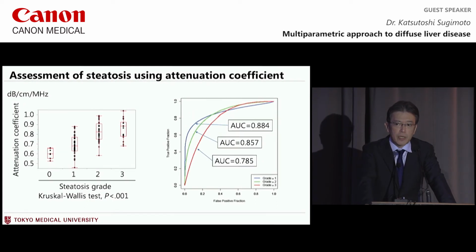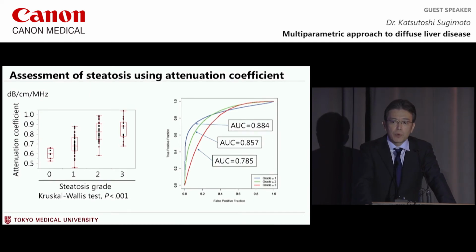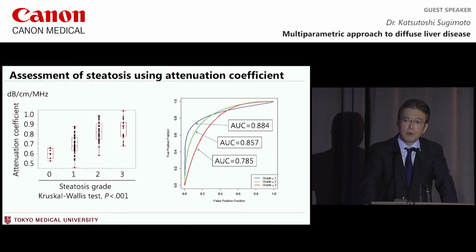This shows the assessment of steatosis using attenuation coefficient. A box plot shows that as steatosis grade increases, attenuation coefficient increases.